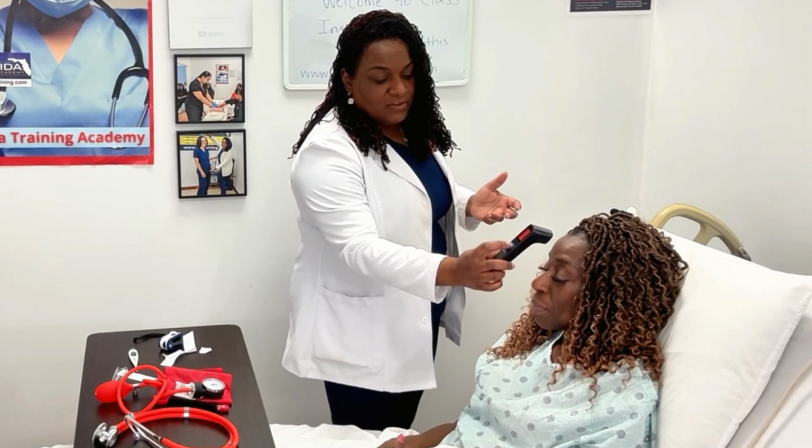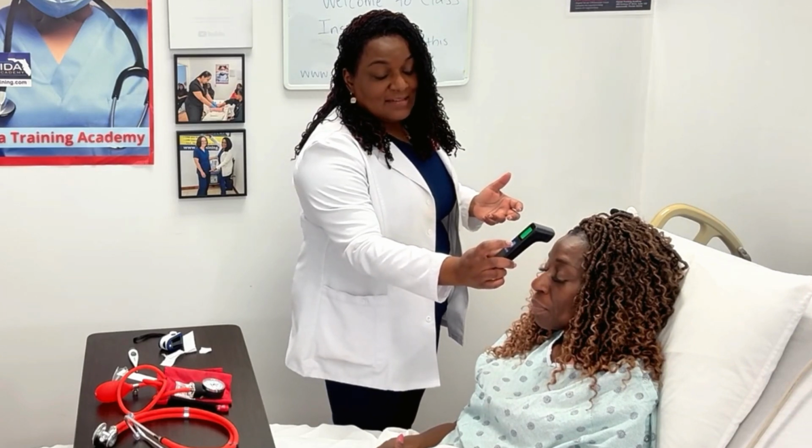So next, let's talk about the thermal reader. This one is really easy to use. You just press a button to turn the device on. You hold it maybe an inch and a half away from your patient's forehead. It scans it and determines the temperature, and it says 97.8. So that would be another way for you to take someone's temperature without using the probes and the probe covers, and it keeps the equipment a little bit cleaner.